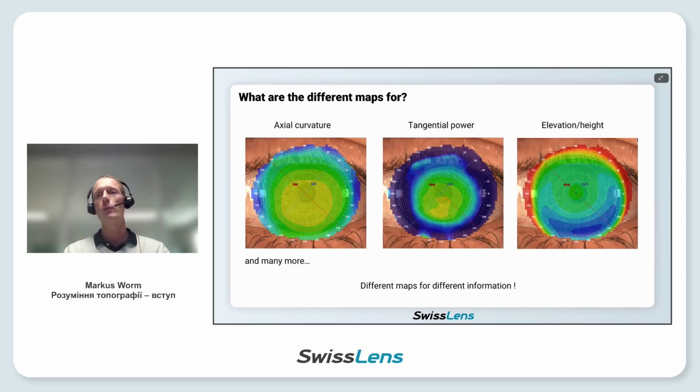And it's the same for the topography of the cornea. It depends on the information that you want to have, which map you choose. And sure, you don't need for every fitting and every examination anytime all maps.